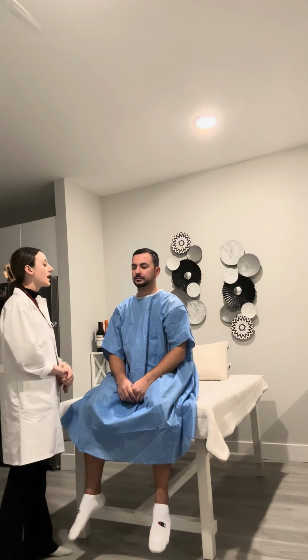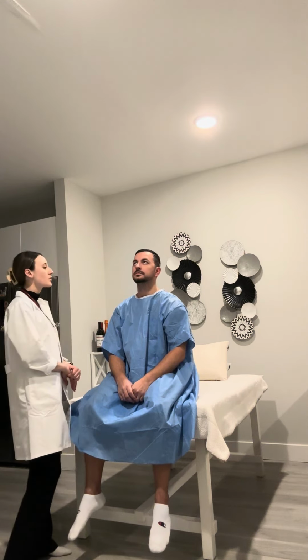The speech is clear and coherent, and recent and remote memory is intact. So now we're going to move on to vital signs. So I'm going to check your blood pressure first.